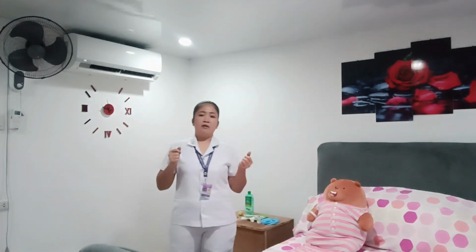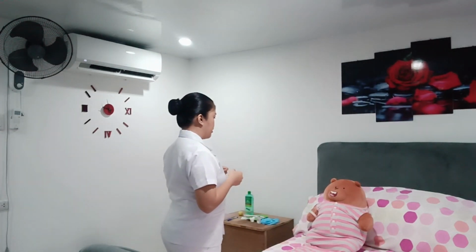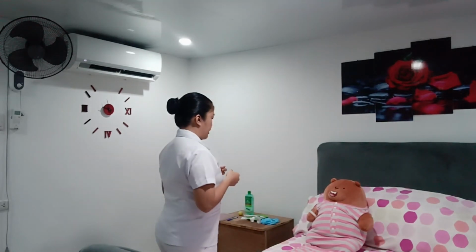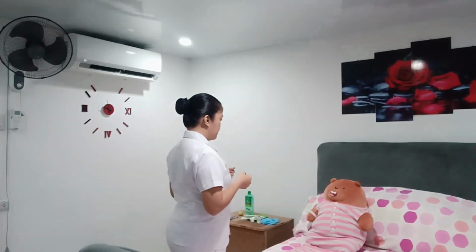Alright? Now I'm going to face the patient and explain all the procedure that I'm about to do for her. Alright, ma'am, good morning. My name is Mark Garcia, your student nurse for today, and today you're going to have a subcutaneous injection, which we're going to do on your arm. And are you comfortable in your sitting position right now?